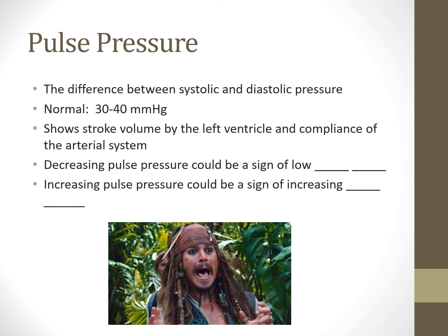So this is very, very important. I cannot stress this enough. There's so many RTs that do not look at hemodynamics before and after their changes, and they can cause a lot of bad effects down the road.